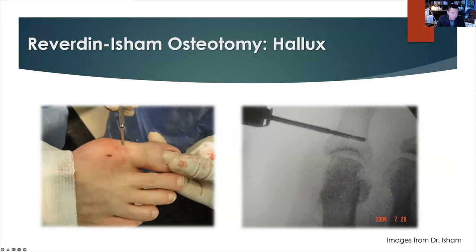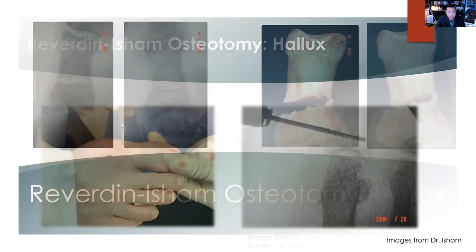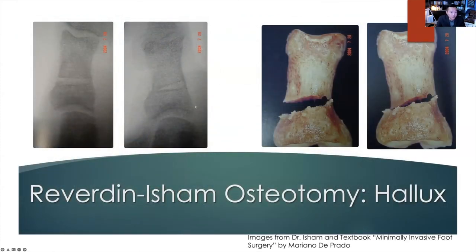And this demonstrates the Akin osteotomy. This is a dorsal medial incision and a sweeping manner from medial plantar and coming up, leaving the lateral cortex intact, and creating a wedge osteotomy of the proximal phalanx of the hallux. And then you can see as it compresses, it closes, and it corrects that HA angle.